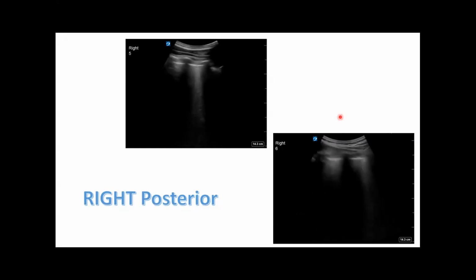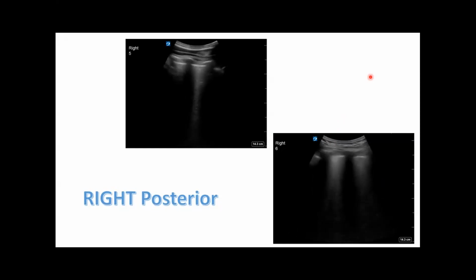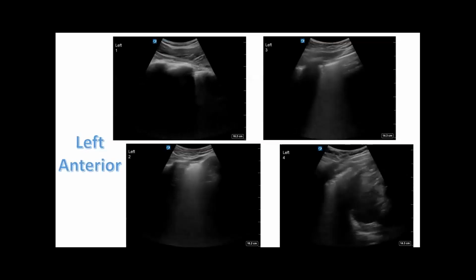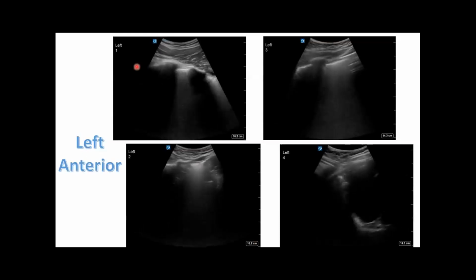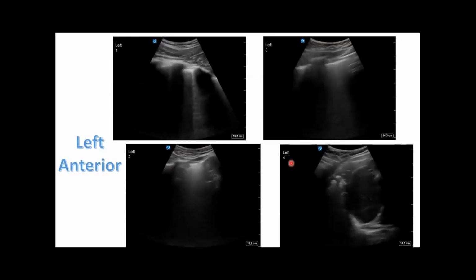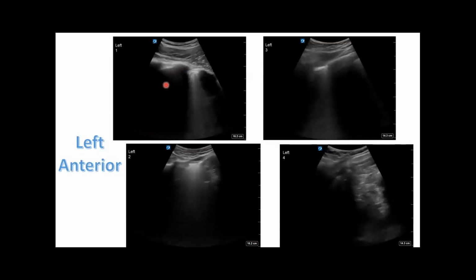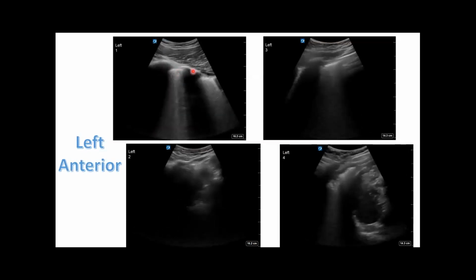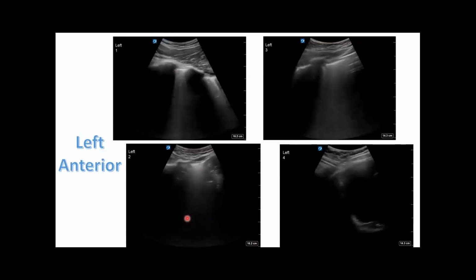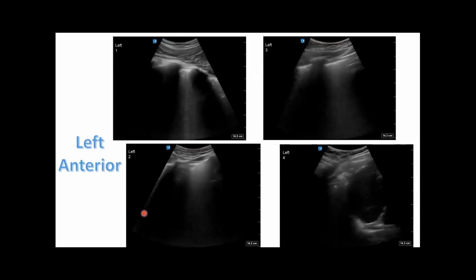We're going to go to the left lung. So again, this is kind of medial to lateral from the left to right. This is L1, L2, L3, L4. So we're seeing rib, shadow, rib, shadow. We're seeing our pleural line right through here, and we're seeing a lot of B lines coming off of it, and that's an L1. L2 sometimes is tricky because the heart's sitting right here, so you may need to slide maybe a little bit more lateral than you typically would.